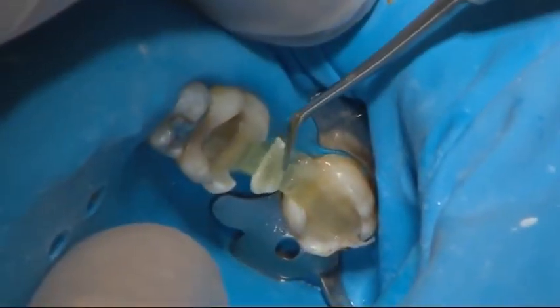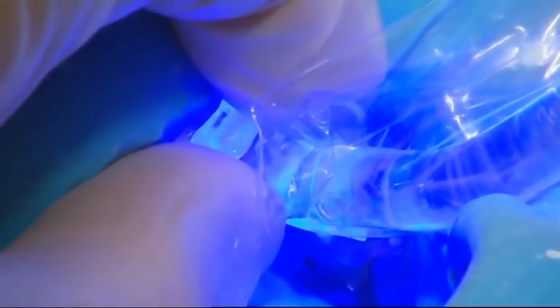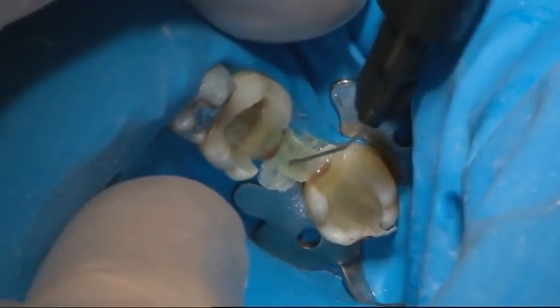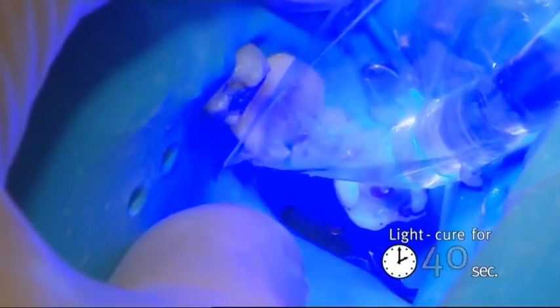Transverse fibres were added to give additional support for the composite pontic. The partially cured fibre frame was covered using flowable composite and characterisation shades. The final light curing of the fibre frame was performed for 40 seconds, one unit at a time.